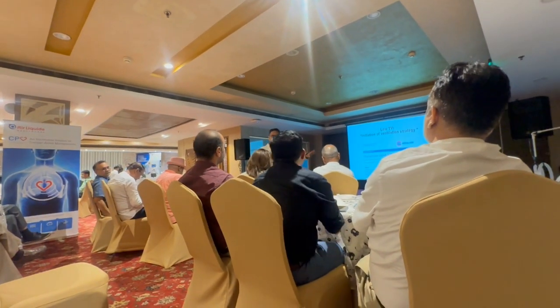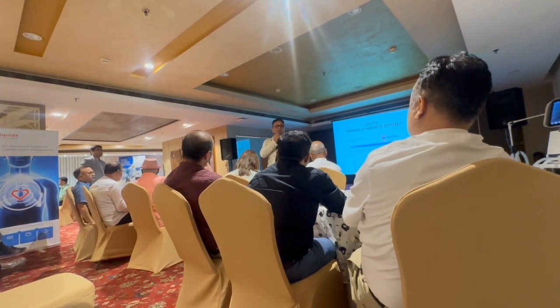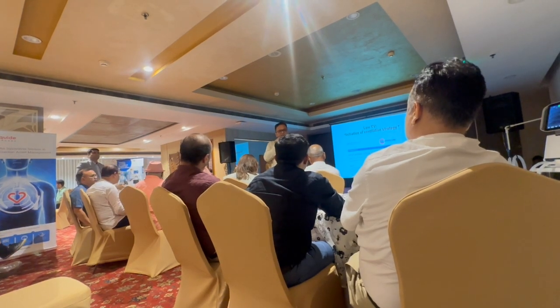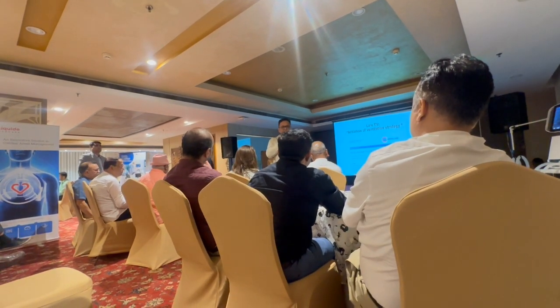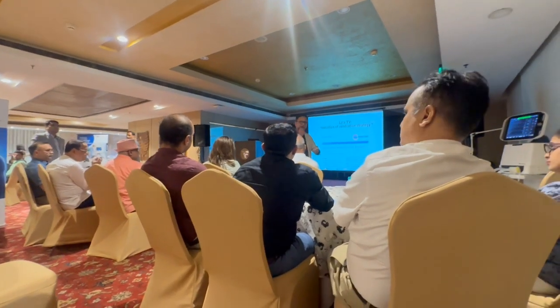Now the question comes. So, Dr. Sumera, and in fact, Dr. Ankit, now I will ask you. We know that we have to give low tidal volume. Now, my question remains the same. Let's say the people who are sitting in the back, especially who have to handle the patient all alone: how do you initiate ventilation? You know that there is a possibility of ARDS, yet not ARDS possibility, as Dr. Sharma has said. What should be your ventilation strategy to begin with?